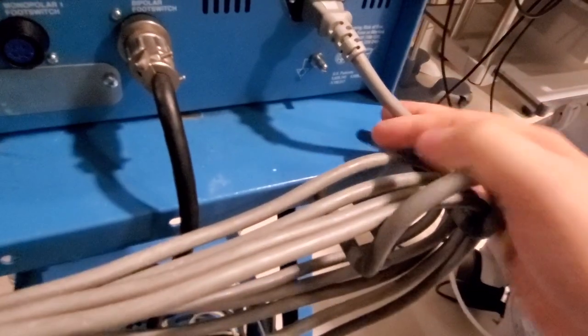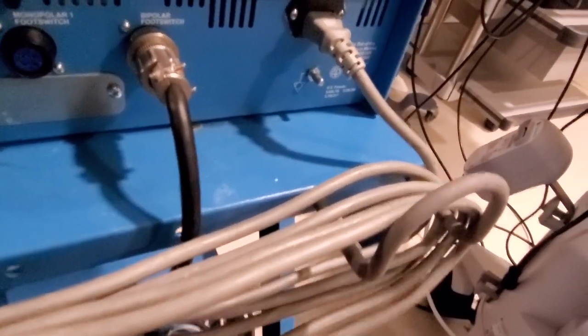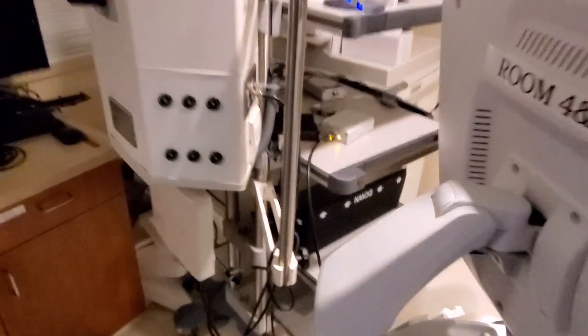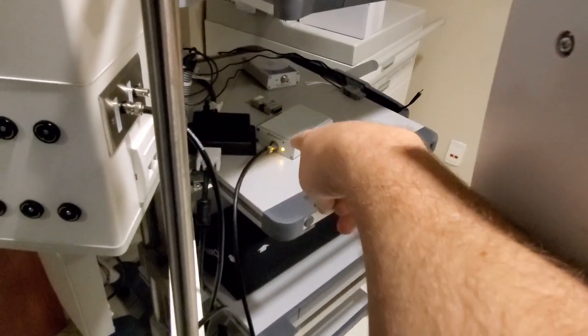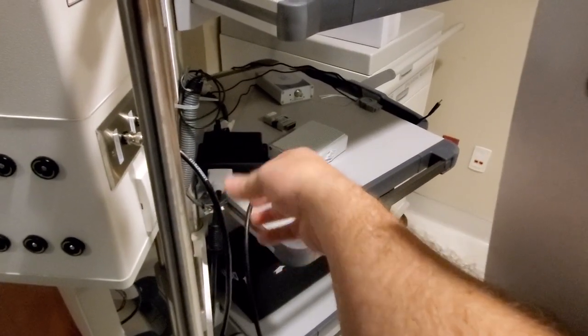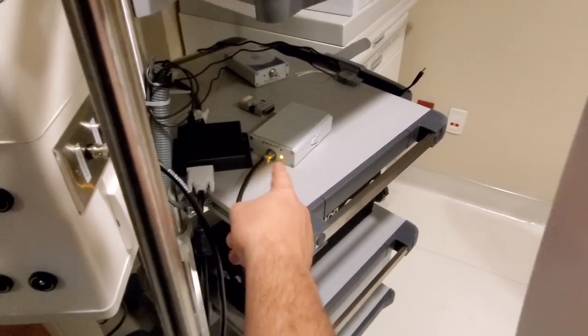So that's a problem. This power cord here, same thing. We could bring it down underneath this and over to the side and zip tie it down, keeps it from being pulled. Now this cath lab is just a perfect example. I could be here all day, because look at this. You get all this cable right here, and all it does is come over to that little box. This coax cable here should be wound up in a nice neat twirl, and it should be fastened right over here, because that is the destination right there.